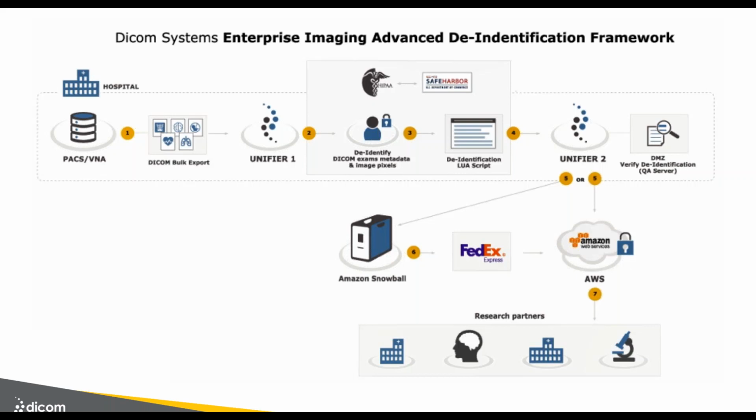In the case of projects where you have either ultrasound devices or images that have been scanned, there's an element of variability that becomes dangerous from a HIPAA perspective. So it's very important before you start de-identifying that you need to decide not only which stations to include in the de-identification project, but also which ones to exclude.